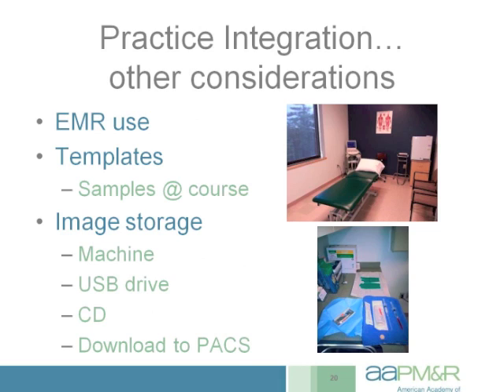There's a few other considerations in practice integration. Most of us are now using EMRs, which can overall be fairly helpful. You can set up a few nice templates or one universal template for your ultrasound-guided procedures. And image storage is also going to be an issue. If you're going to be billing for ultrasound guidance, you're going to have some way of storing your image.